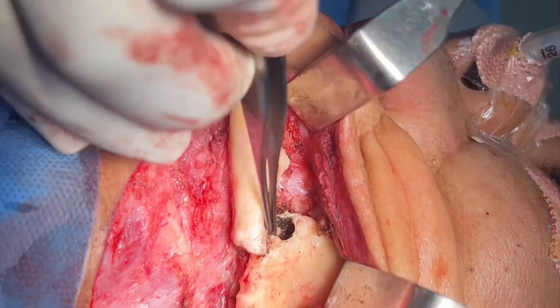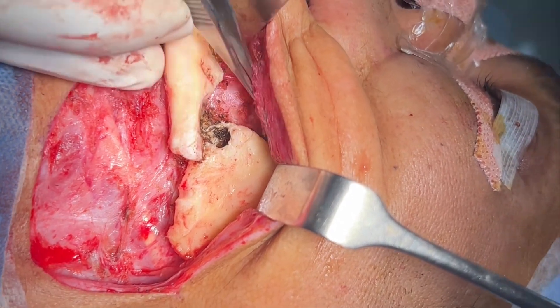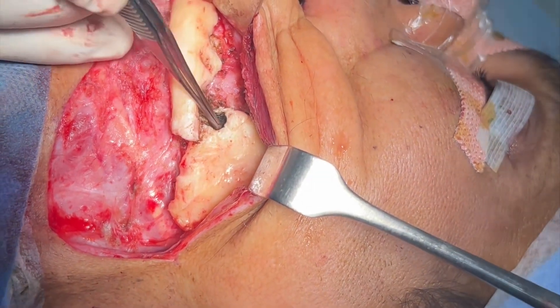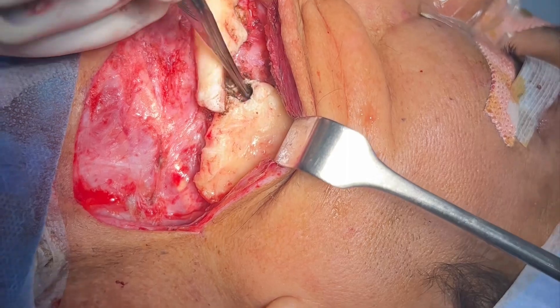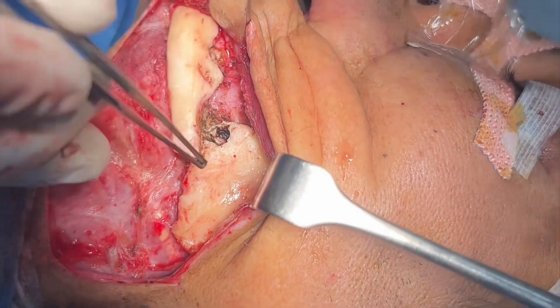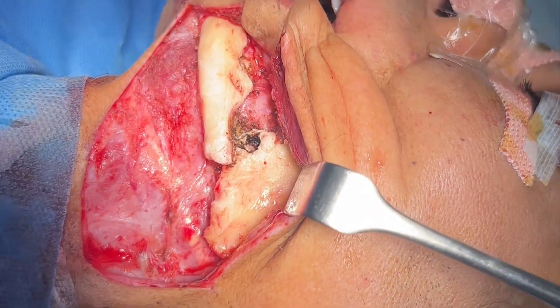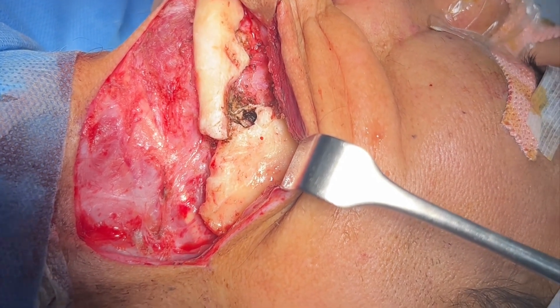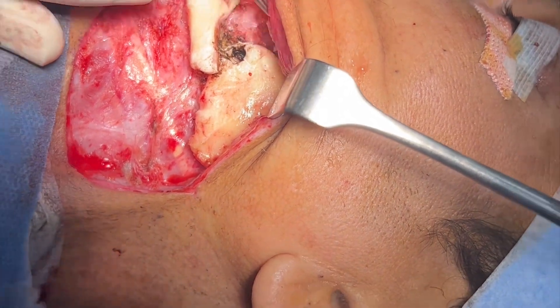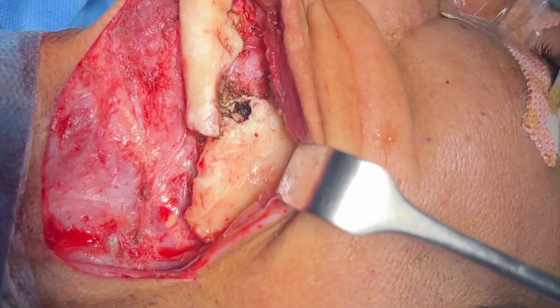This side the bone is pencil thin, and there's also a fracture line here. We're going to be doing iliac crest bone grafting to fill up all of this defect and reinforce it with some plates to fix it, and also a defect here. We've removed all soft tissues and freshened them up so the new bone will take up well. Vascularity is very very low because of the earlier radiotherapy, and because of the pathological fracture there's severe scarring. We've taken care of all of that — the area is now ready to receive the bone graft.